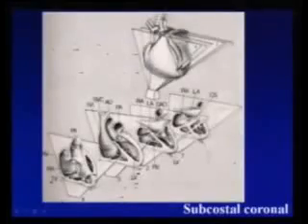The most posterior structure is the coronary sinus, so you will get this view, with the coronary sinus forming the floor of the left-sided atrium. As you go anterior, you will get the subcostal four-chamber view. Then you open the aorta, and the pulmonary artery is the most anterior structure. So the most posterior is the coronary sinus, then the AV valves, then the aorta and the pulmonary artery. You will scan all these from posterior to anterior.